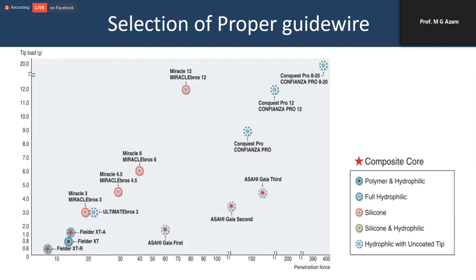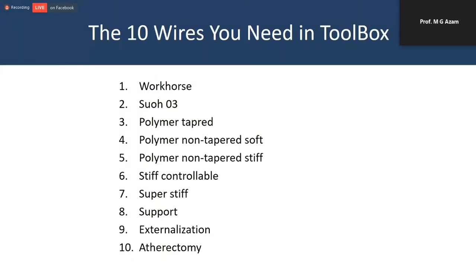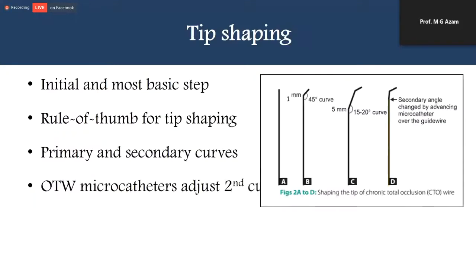The more penetration force required, when you should increase your tip load, then in that particular situation, you should choose either the tapered tip or a blunt tip. That will help you a lot. Either you go for puncture or drilling method. Then you see 10 wires should be needed in a toolbox, but not necessarily every wire should be present in your cath labs.